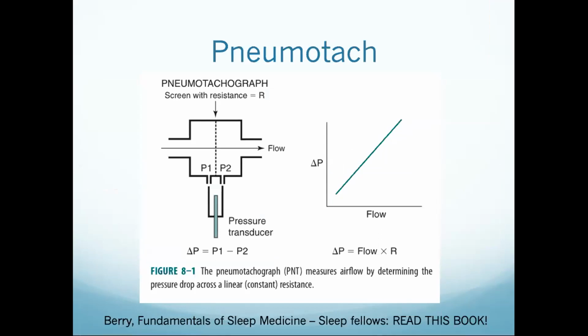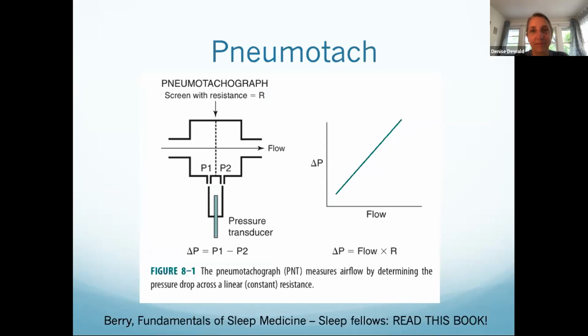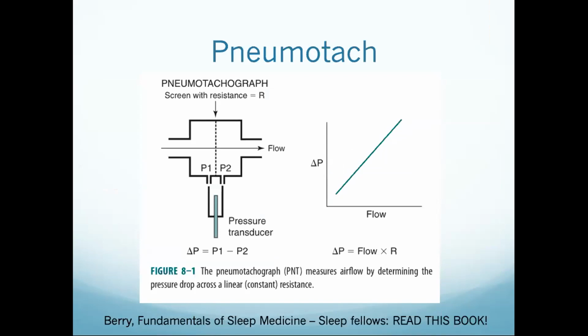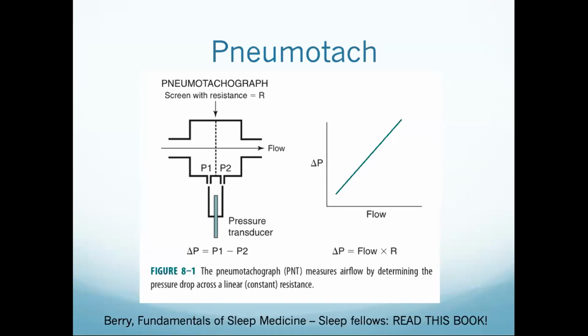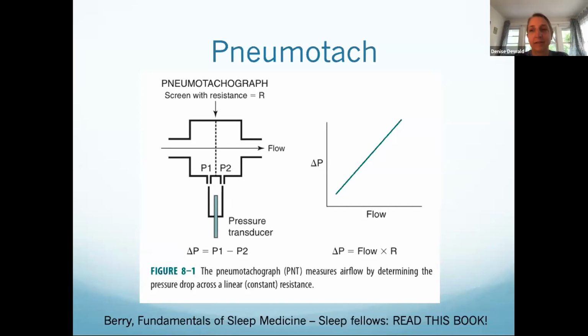Sir. Yes, ma'am. So basically, so I can understand, I'm just trying to look at the math here. It has a known resistance, so it's deriving the flow from the change in the pressures. Exactly. Yes, the change in pressure across a device in which the resistance is known.